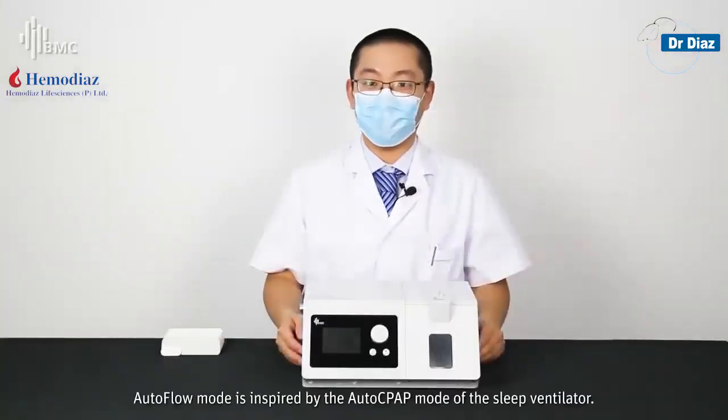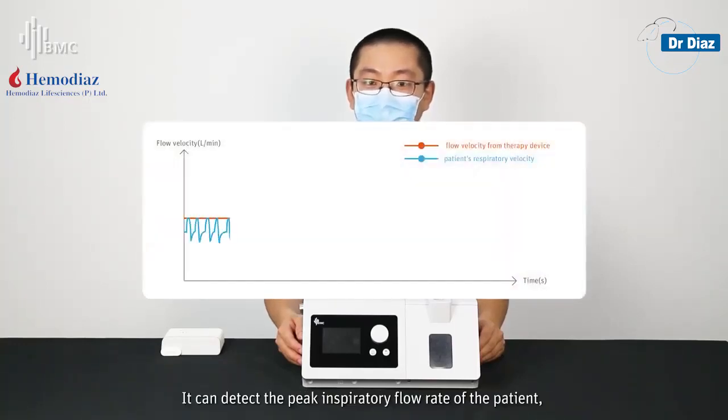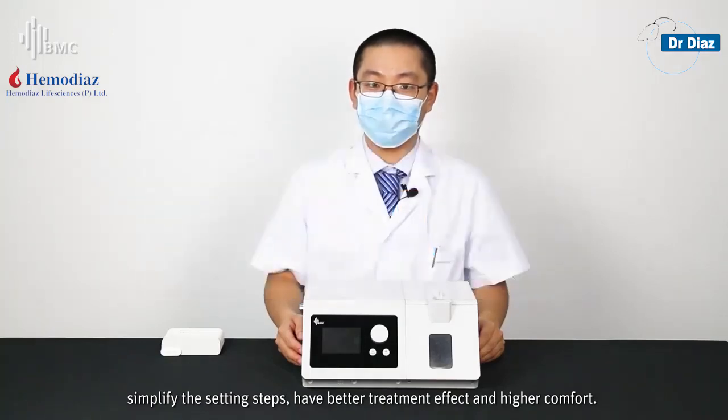Auto Flow Mode is inspired by the Auto CPAP mode of the sleep ventilator. It can detect the peak inspiratory flow rate of the patient and automatically adjust the output flow to meet the patient's needs, simplifying the setting steps and providing better treatment effects with higher comfort.